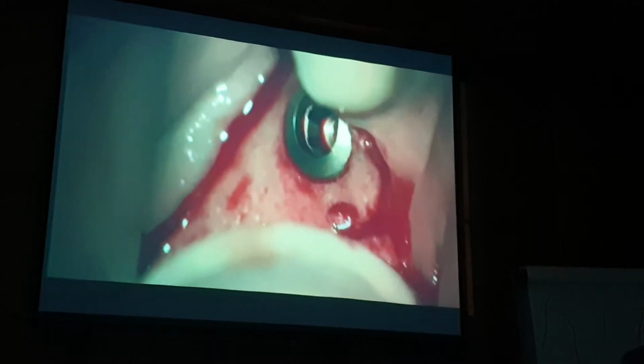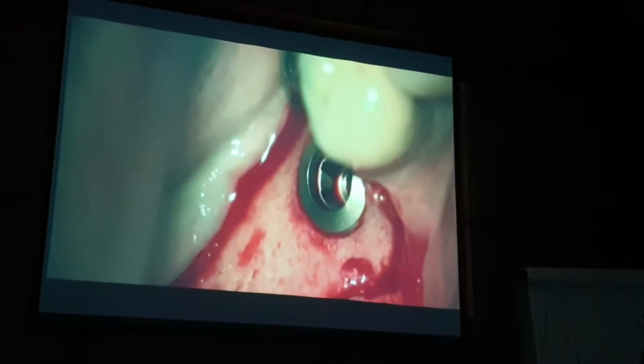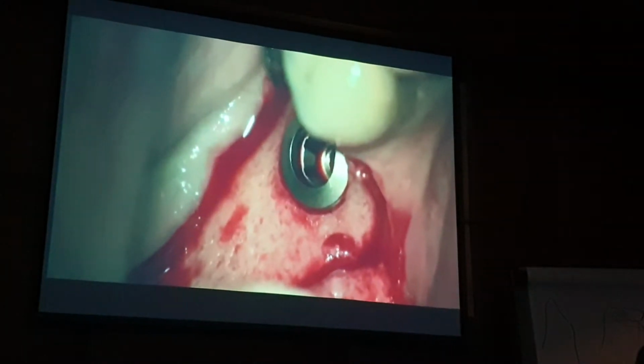75%. See, the implant is wet? It's wet because I dipped it in the bottom of the PRF box. We're going to show you how to do that tomorrow. We place this in position. Here's our first 6 millimeter wide implant. Then I place the second one more posterior. Let's put the bone on the other side of it now. And one more posterior here. There's our second one. And it reaches like that, anybody can place an implant in this.